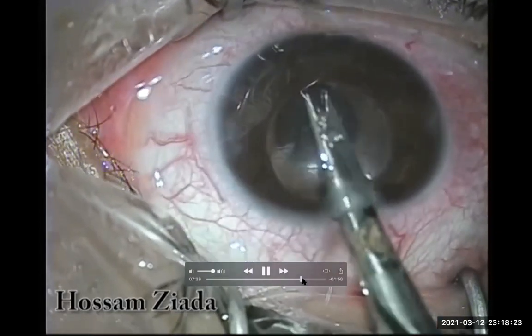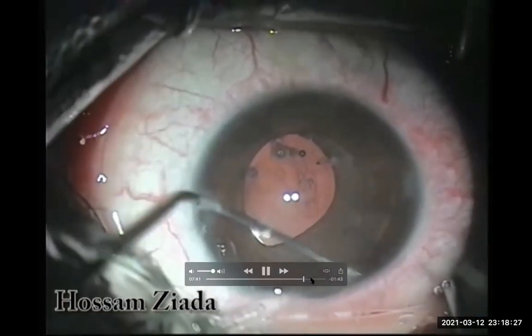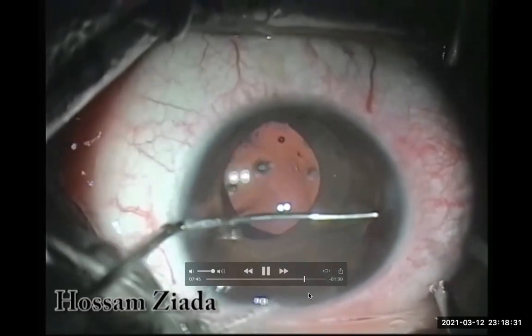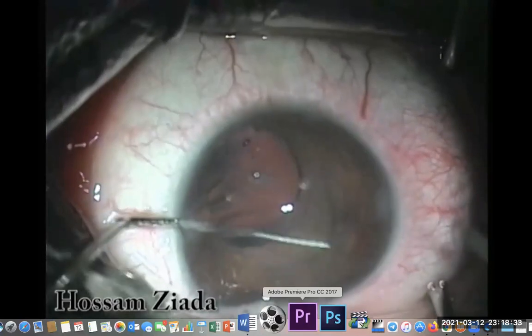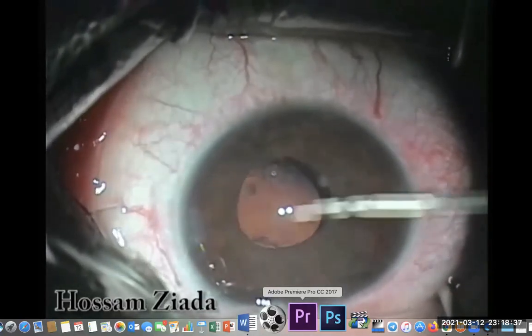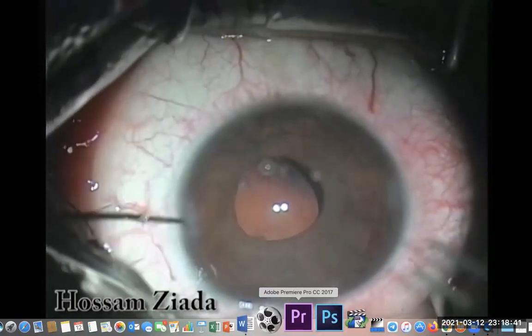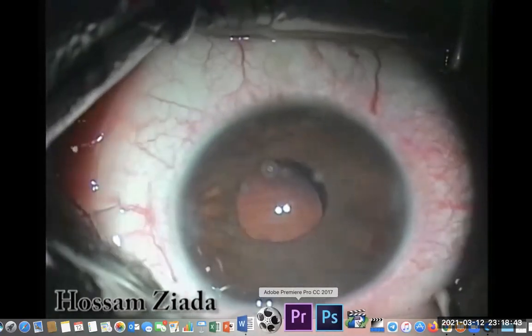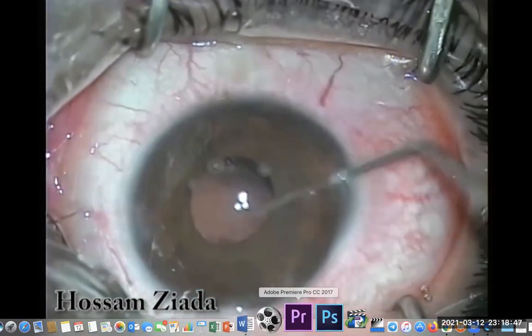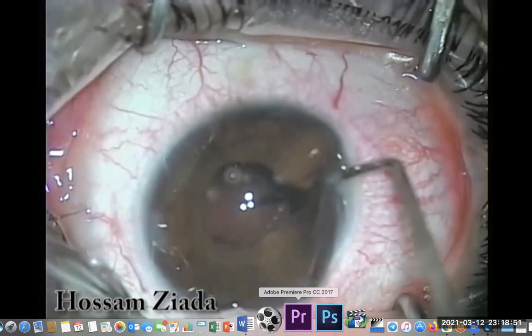The same procedure is performed for the other haptic. It's quite more difficult than the first one because it's free and not supported like the first haptic — it's down now. I would be careful not to slip the first fixating point during manipulation of the second haptic.